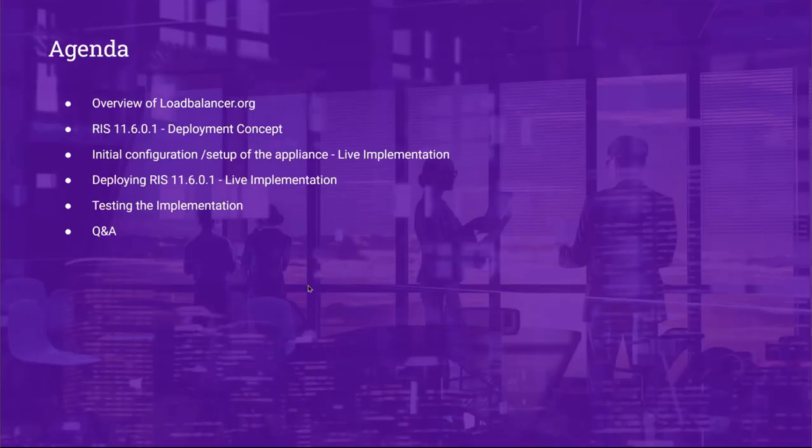If we take a look at the agenda today, it is going to be an overview of Loadbalancer.org that I'll be delivering, so it will touch on who we are as a business, our healthcare specialisation, the relationship between Philips and Loadbalancer.org, and quickly touch on the new hardware update that we have made to our solution and our offering to you. Then Damien's going to run through the RIS deployment concept and then give an initial configuration and setup of the appliance in a live implementation, so you can see how to set it up from scratch.